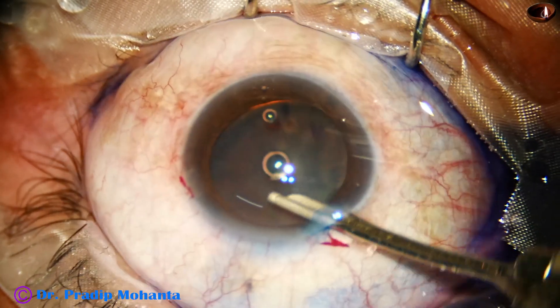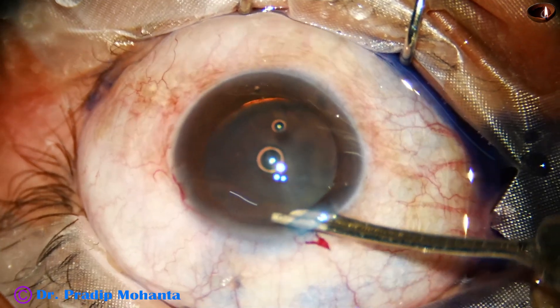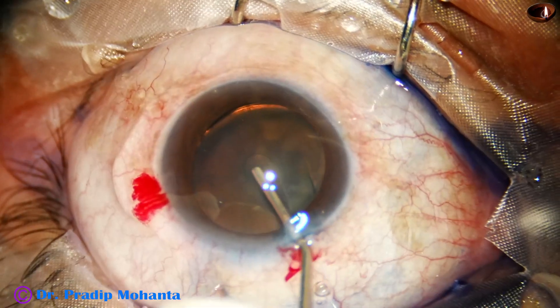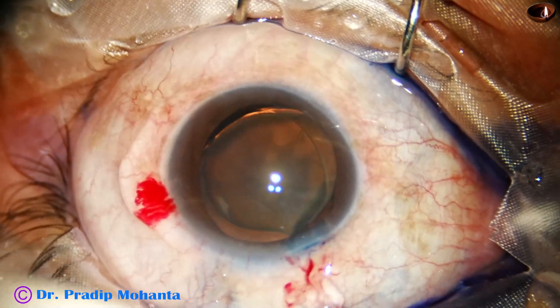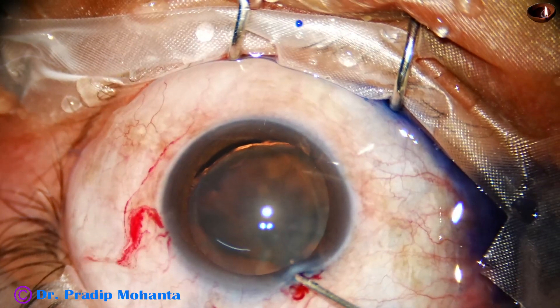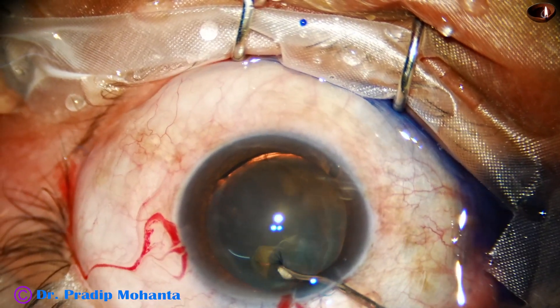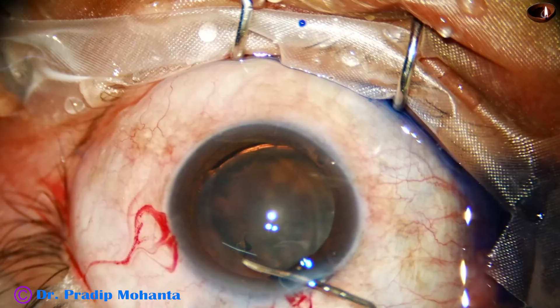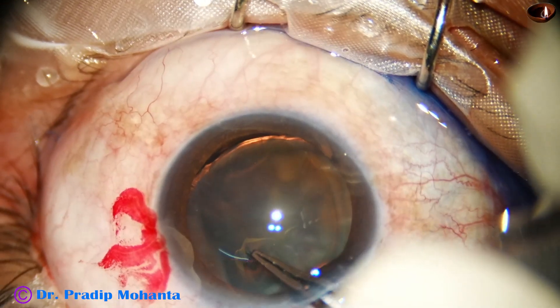The idea of plugging the dehiscence area is to prevent the dye from going into the anterior vitreous. If it goes into the anterior vitreous, we lose all the red glow. So we should plug the dehiscence area with any combination of sodium hyaluronate and chondroitin sulfate, and then start staining.